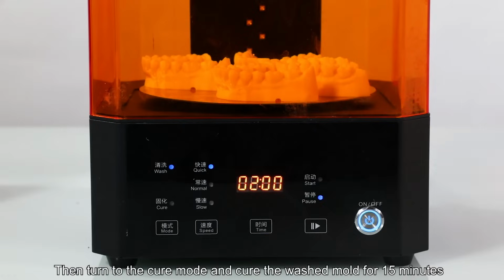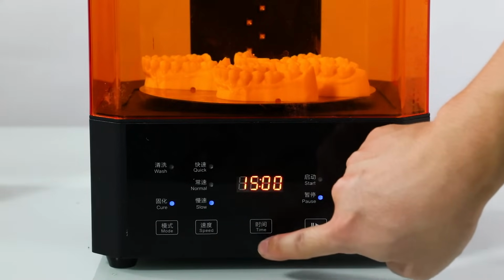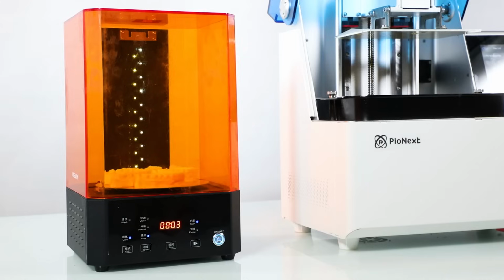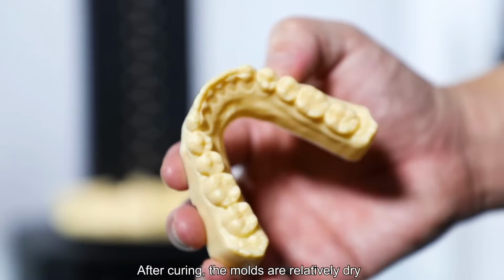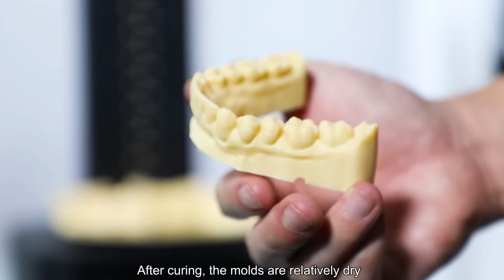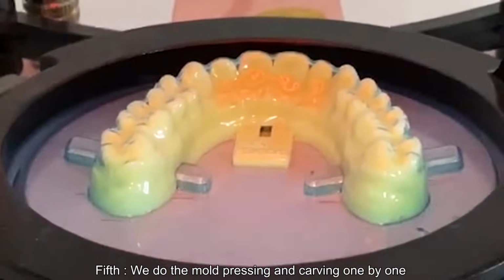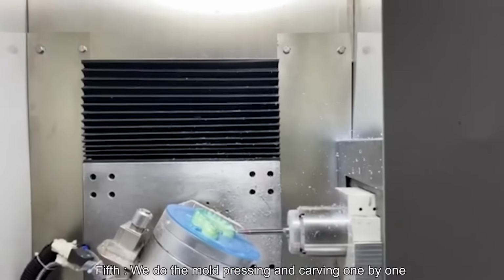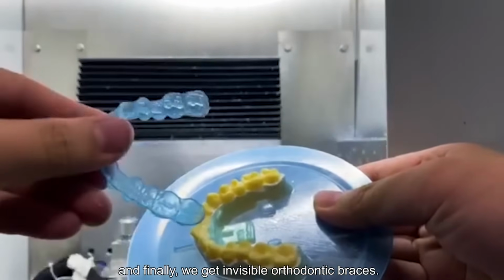Then turn to the cure mode and cure the washed mold for 15 minutes. After curing, the molds are relatively dry. Fifth, we do the mold pressing and carving one by one, and finally, we get invisible orthodontic braces.